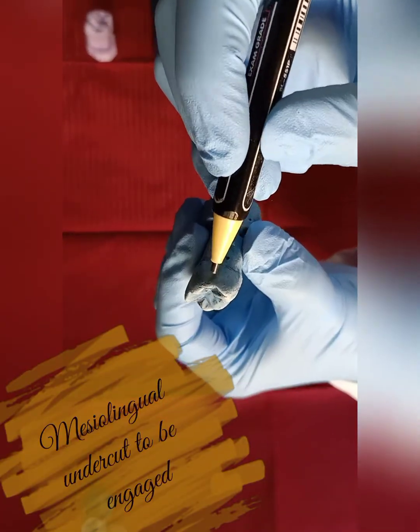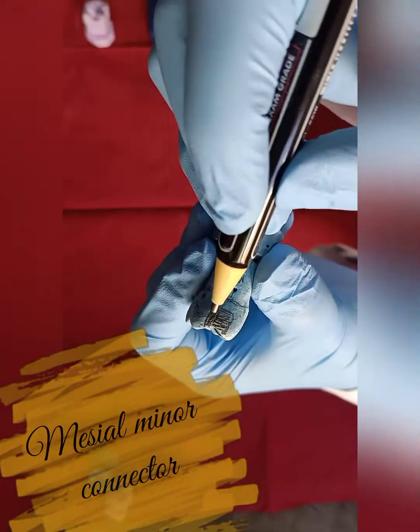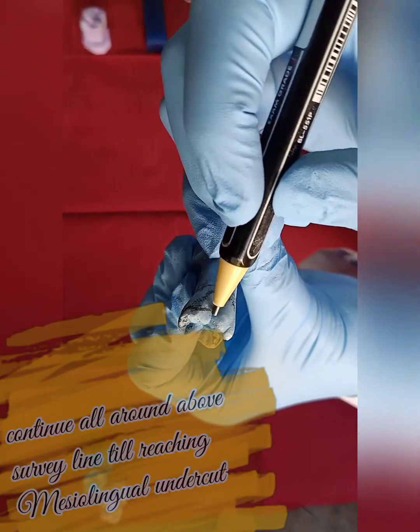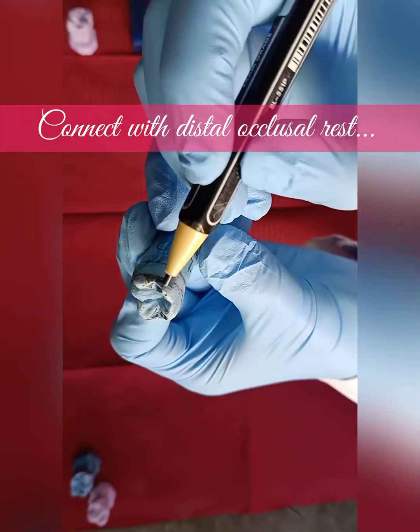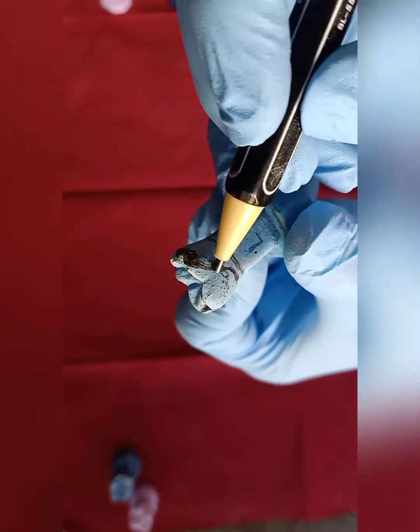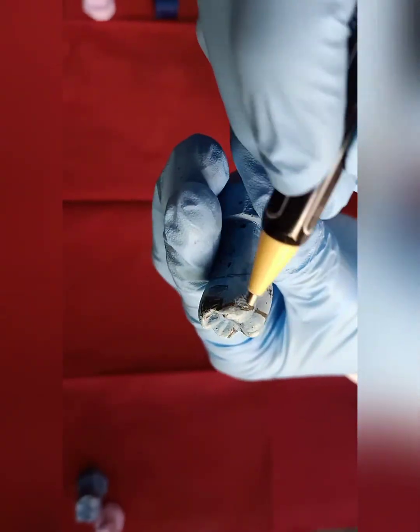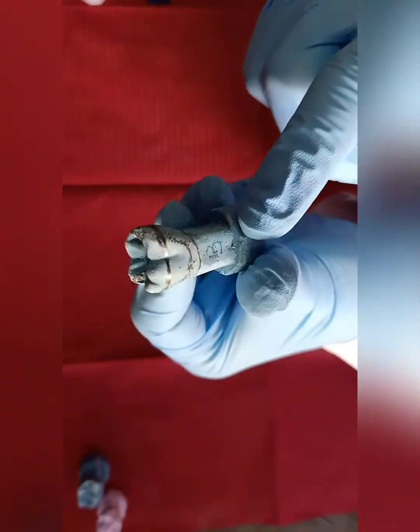In the lower, we have to engage the mesiolingual undercut. Draw the mesial minor connector from where we are going to start our design. Go around the tooth, all around above the survey line, till reaching the mesiolingual undercut, and the retentive arm, which is in the lingual surface, is all above the survey line, and only the retentive terminal is engaging the undercut.